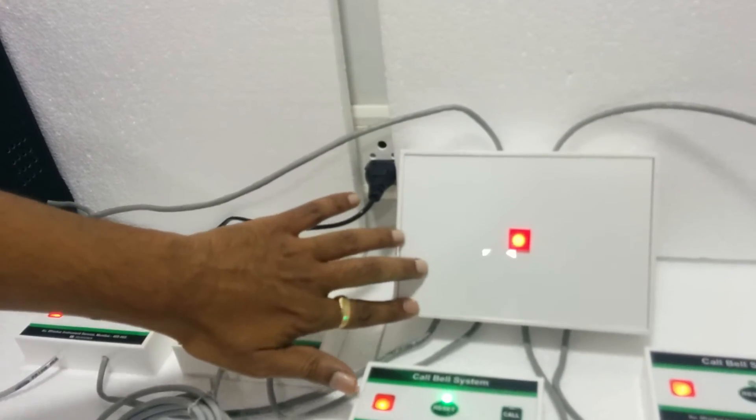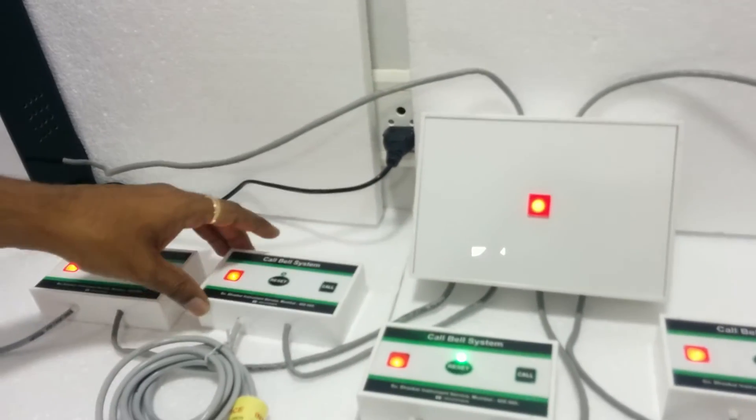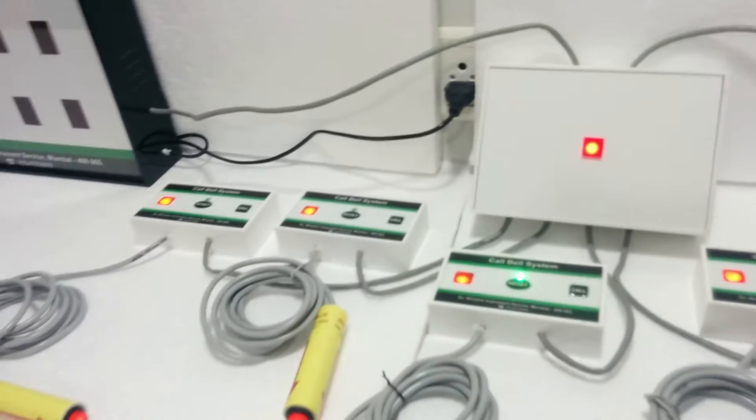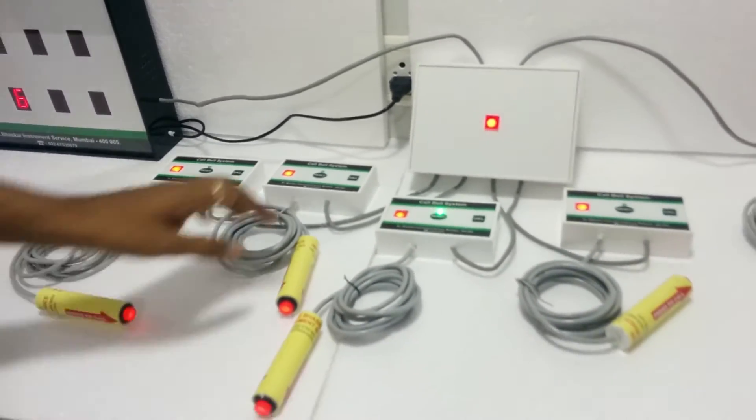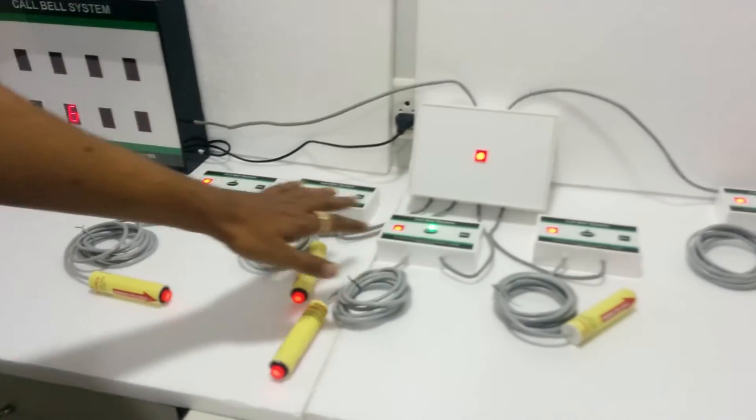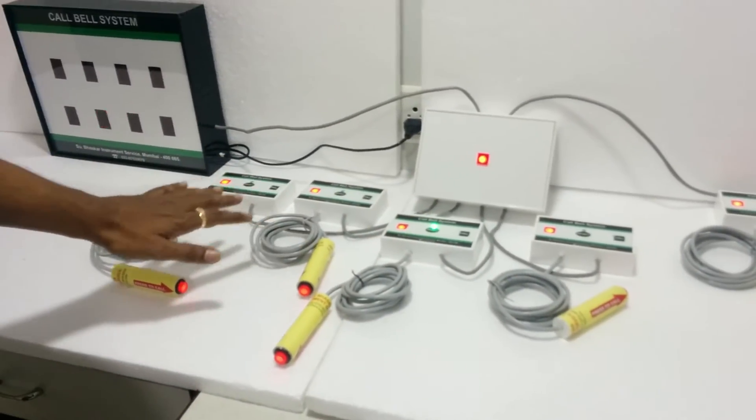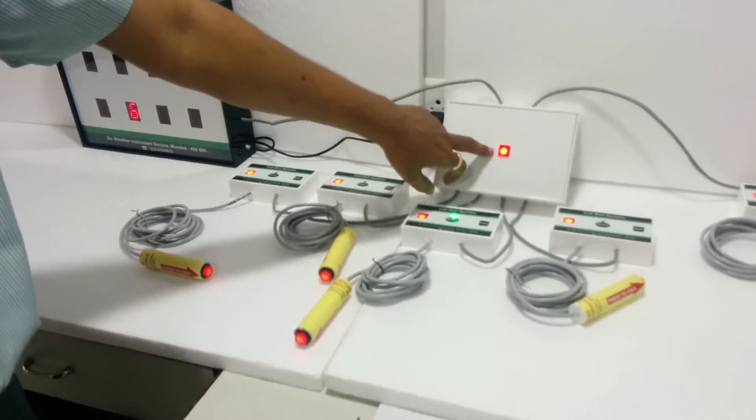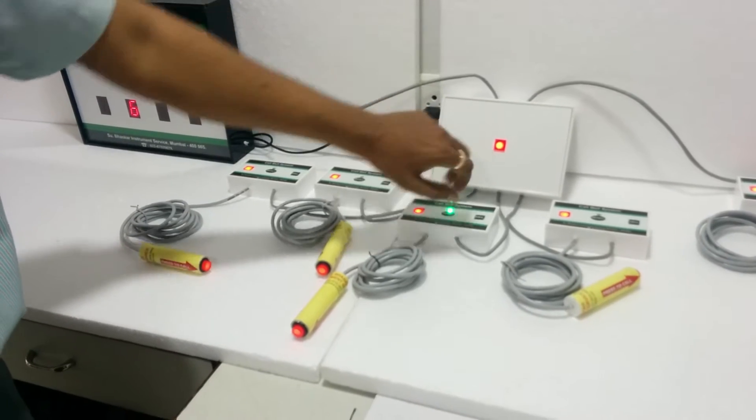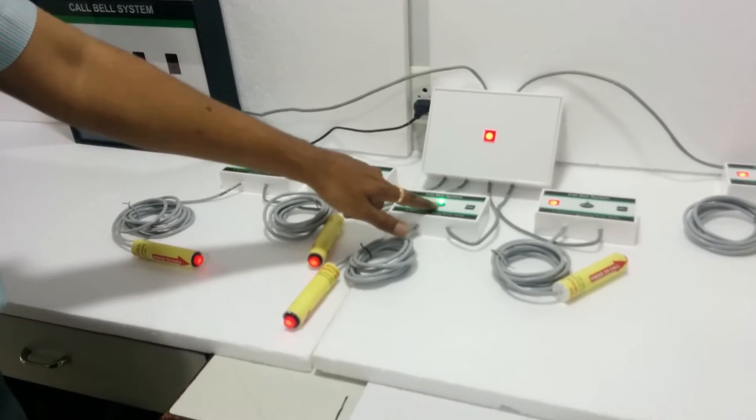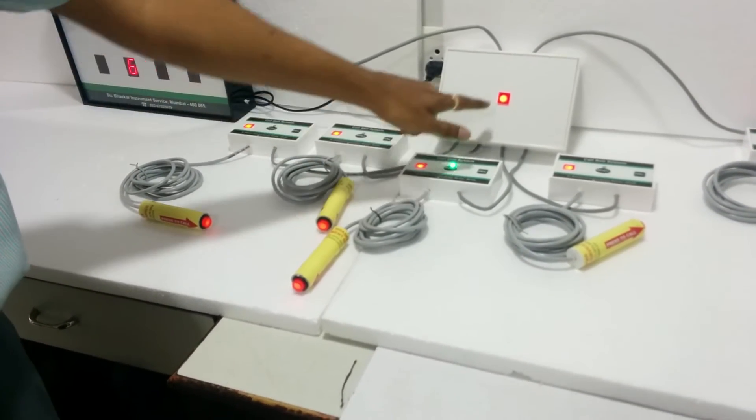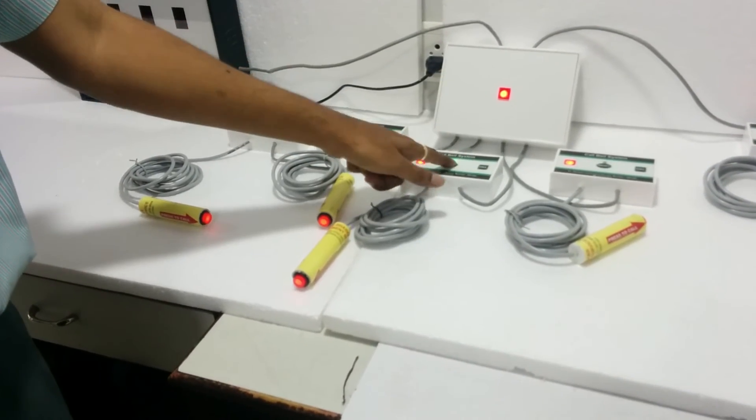One junction box can carry 4 beds. So if any of them calls for the nurse, this light glows outside the ward. If all stations are clear, this will go off.